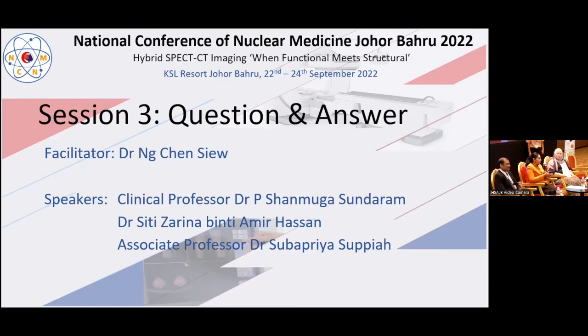But with the contrast, it can be like 3 to 4, let's say. So you will then get used to a higher baseline, but you would then base the lesion on a higher value. Is it higher than the liver? And then you base your Deauville criteria on that. Yeah. So from that study, we didn't look at the SUV of the liver increment, because the lesion is 20%, whether the increment was the liver increase, also the 20%. Yes.